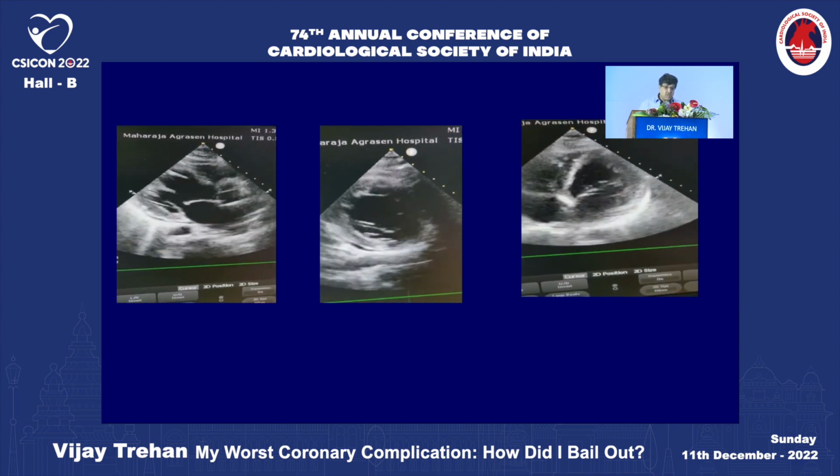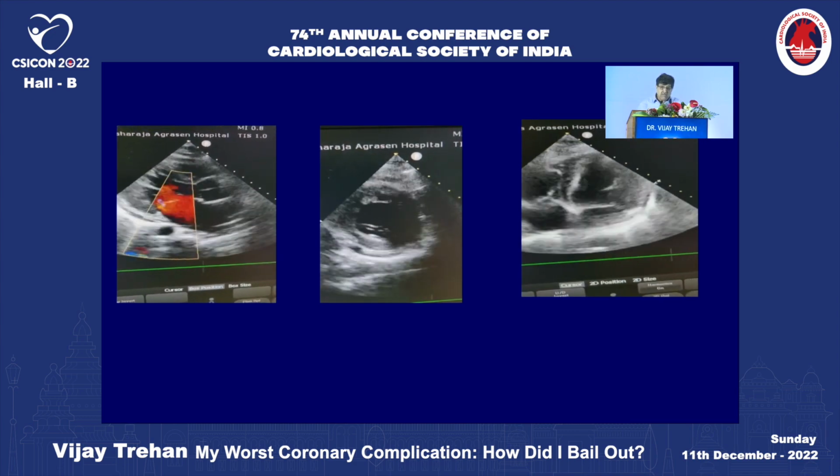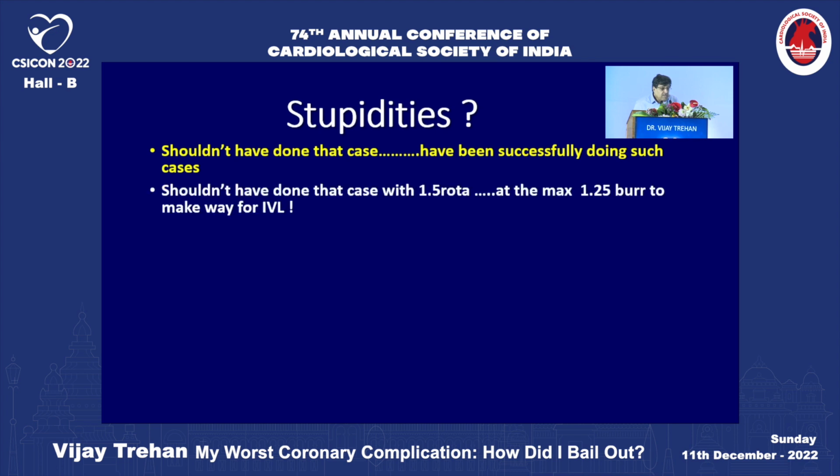This story is about 1.5 months old, and the patient is doing fine. His symptoms have totally disappeared. Let me just talk about stupidities. I shouldn't have done this case. Well, we have been doing such cases successfully, not one, hundreds of such cases we have done.